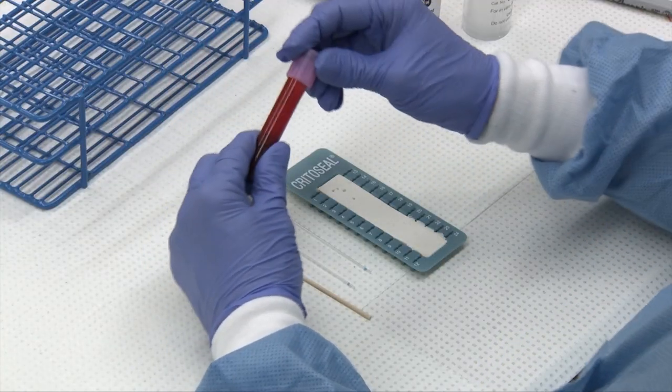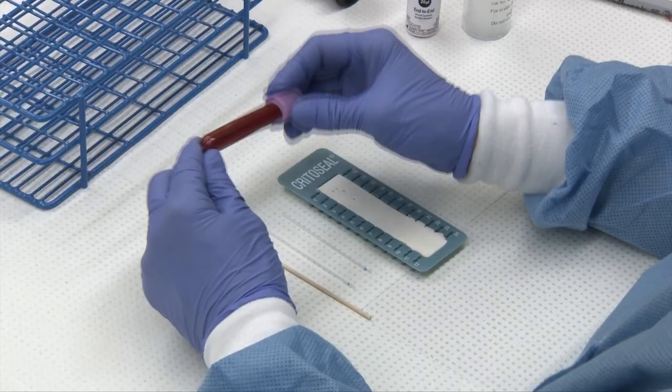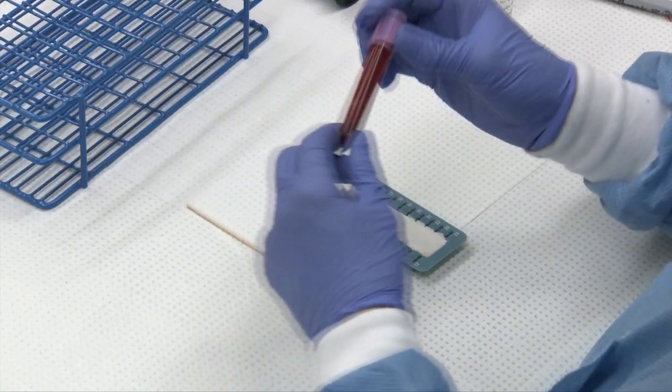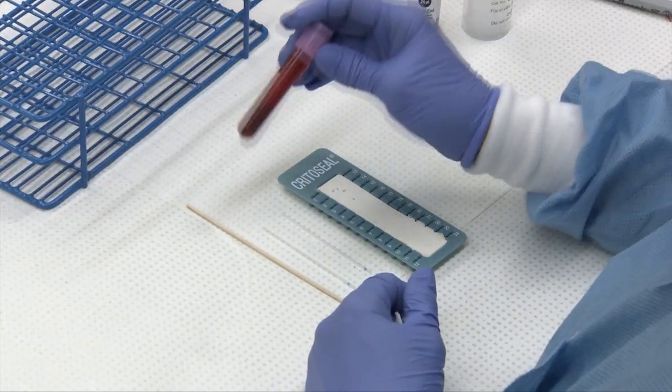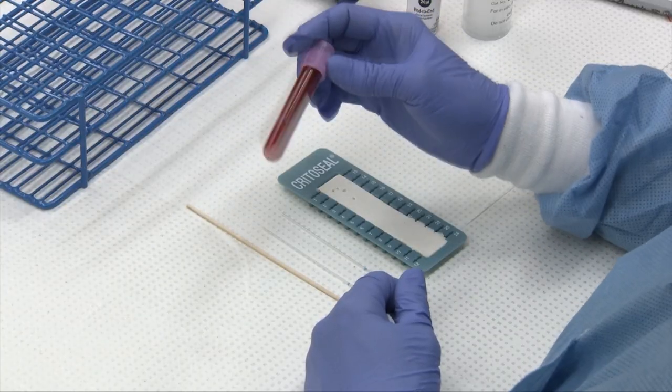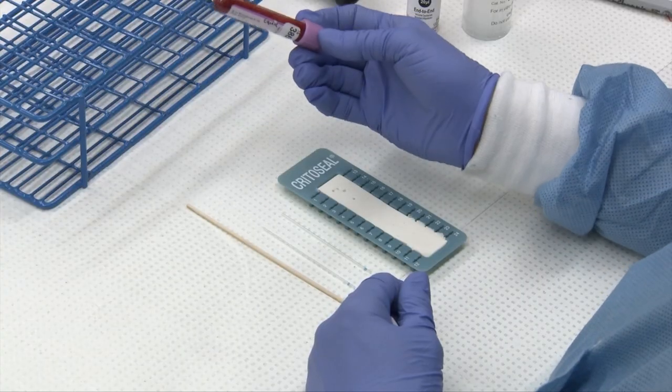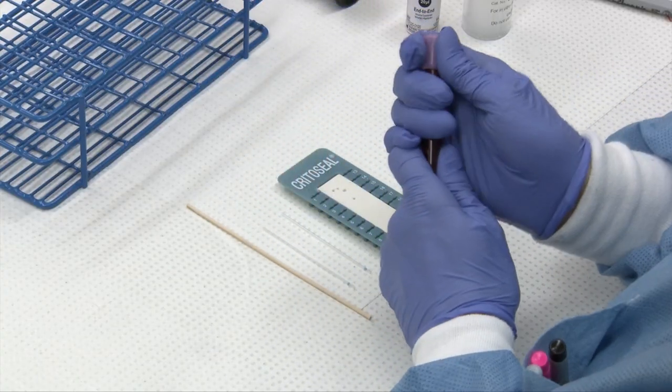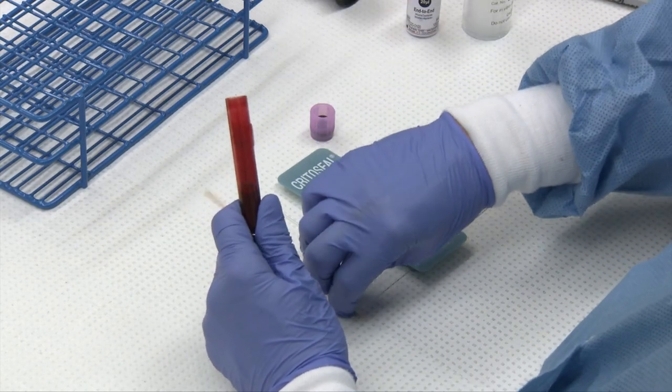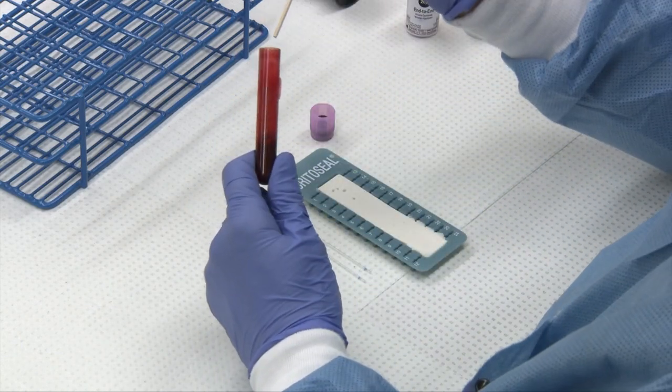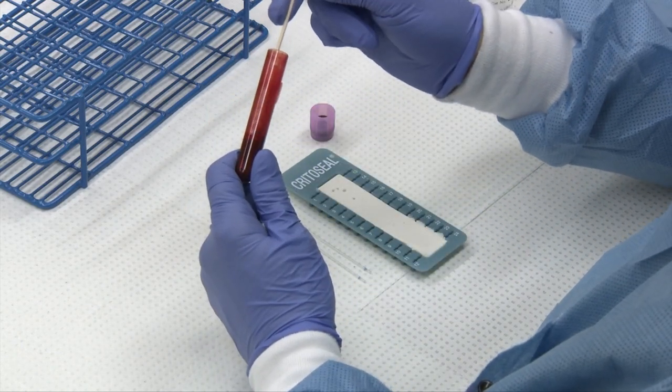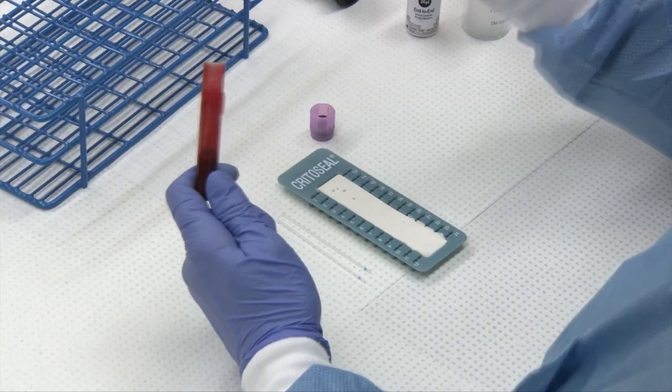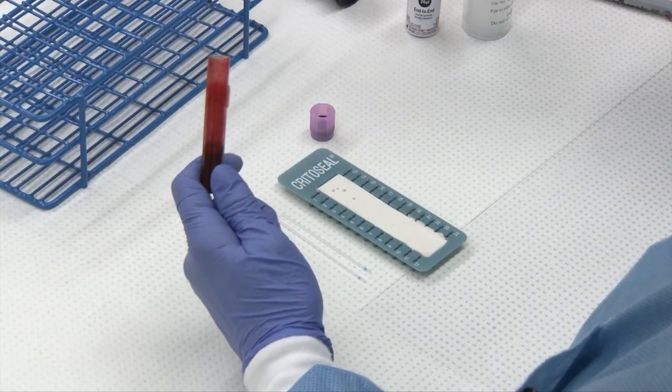You want to start with an EDTA tube that is unclotted and well-mixed. Mix your tube after collection by gentle inversion and prior to doing any testing because the blood will settle out. If you are concerned there might be clots in your sample, take an applicator stick and run it around inside the sample and any clots will appear on the stick. If there's no clots, you are good to go.